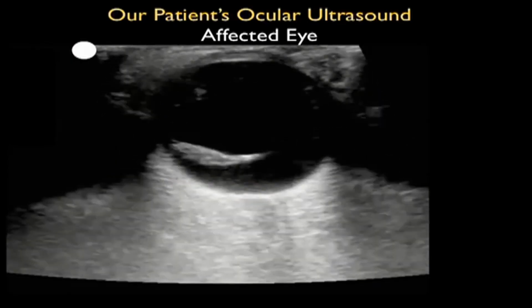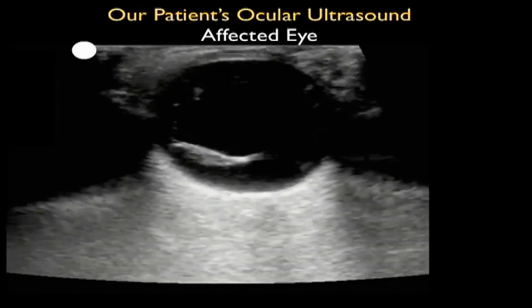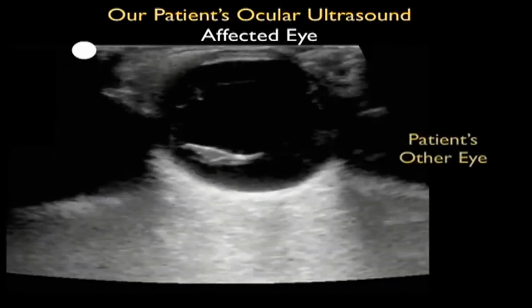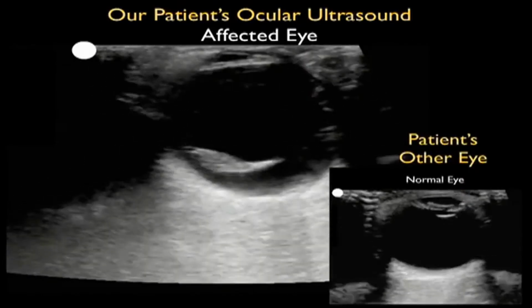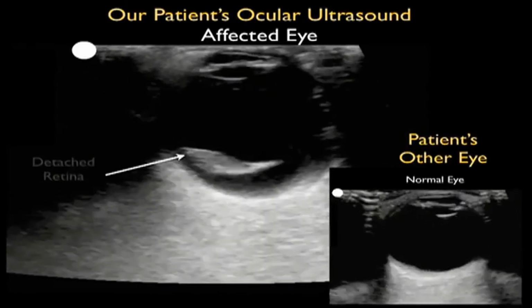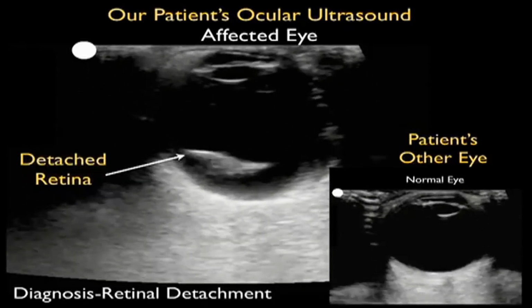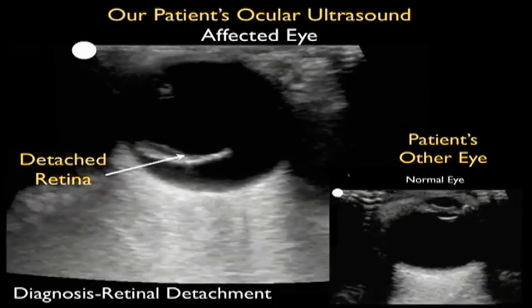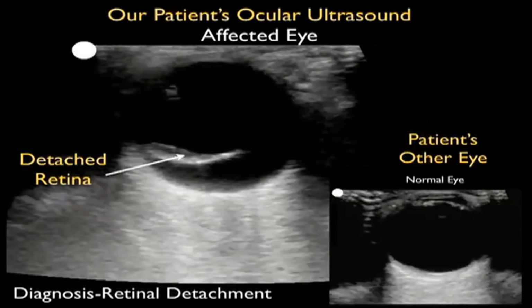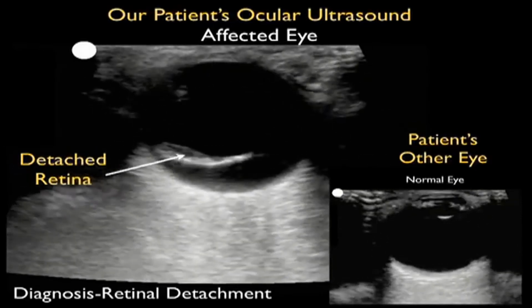Now let's return to our patient's ocular ultrasound, placing the probe in a side-to-side or transverse orientation over the affected eye. Right away we note that there's pathology within the posterior aspect of the eye, and we can see a hyperechoic or bright structure waving around in the posterior aspect of the eye that should not be there. We'll look at the patient's other eye in the small video to the right, and we note here the normal appearance of the retina tacked down to the choroid. So in the affected eye, this is actually a detached retina that's moving around as the patient looks up and down, and we have the probe positioned over the patient's eye. So right away our diagnosis within immediate orientation of the probe onto the eye is retinal detachment.